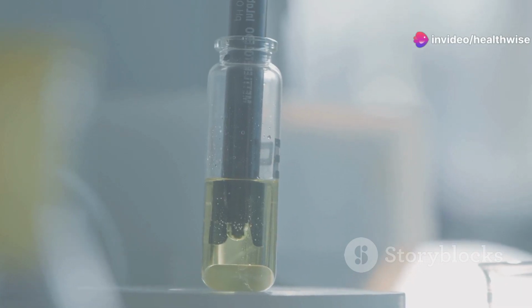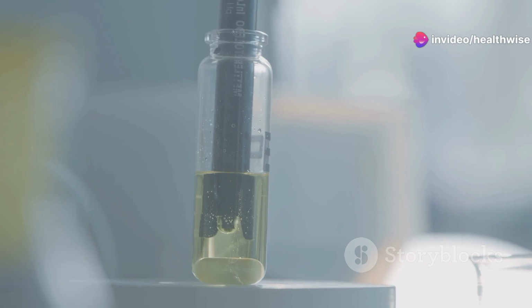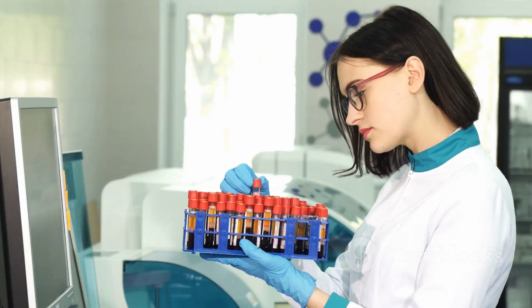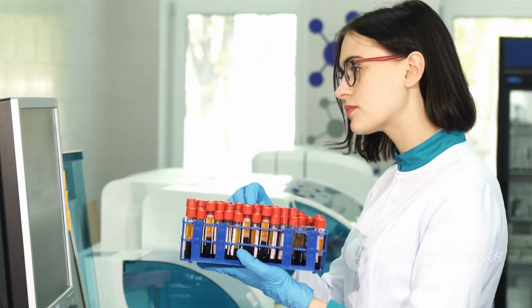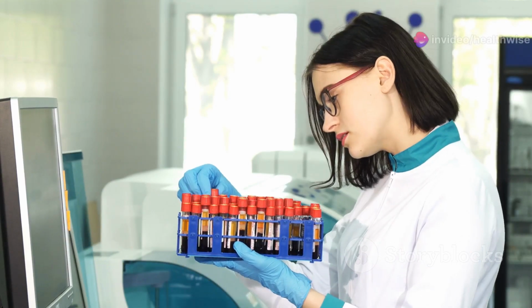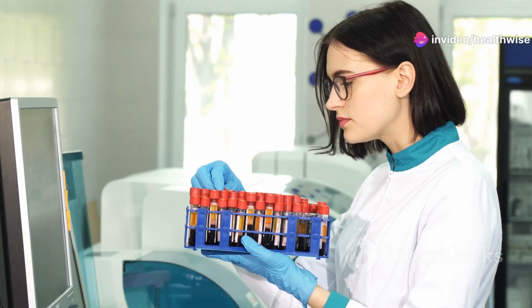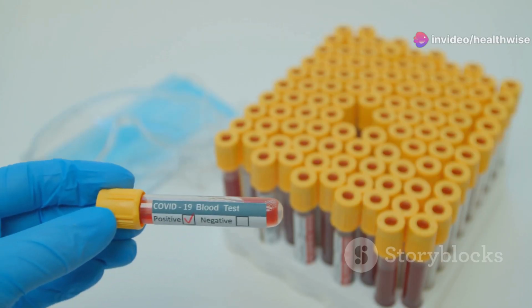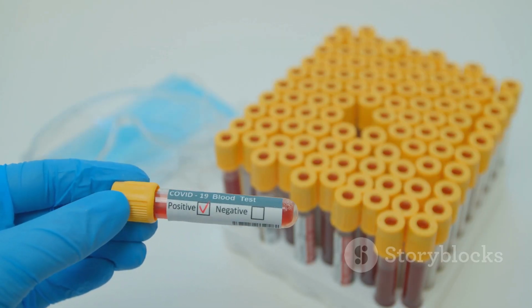Hey there, medical students! Today, let's dive into the essential tips and techniques for estimating glucose levels in cerebrospinal fluid, or CSF. First things first, glucose in CSF is rapidly destroyed once the fluid is collected, so it's crucial to carry out glucose estimation as soon as possible. If there's likely to be a delay, the CSF should be preserved in fluoride oxalate to maintain its integrity.